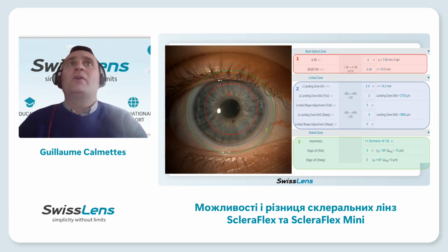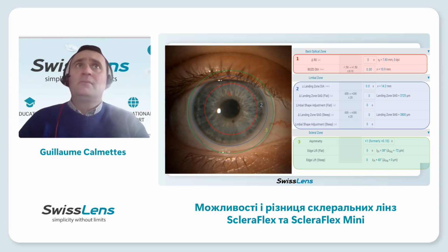In red, for part 1, you have the back optical zone. You can change the base curve and you can change the diameter of this back optical zone. So it's only for the red. The limbal zone is the blue one, so it's zone number 2. You can play with the diameter, you can play with the sag, you can play with the shape.